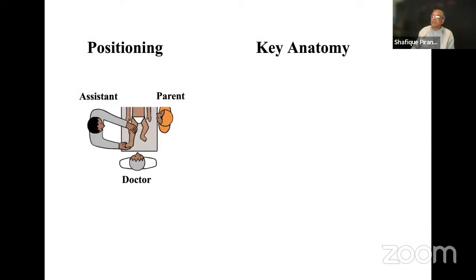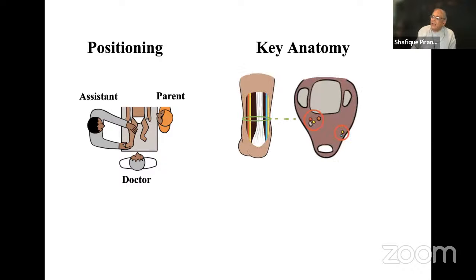And the positioning, I like to do the tenotomy with an assistant holding the leg. A parent can be in the room if they want to be. If you're comfortable with that, they can comfort the child. The foot is positioned right at the end of the bed. Here we're going to show the right foot.